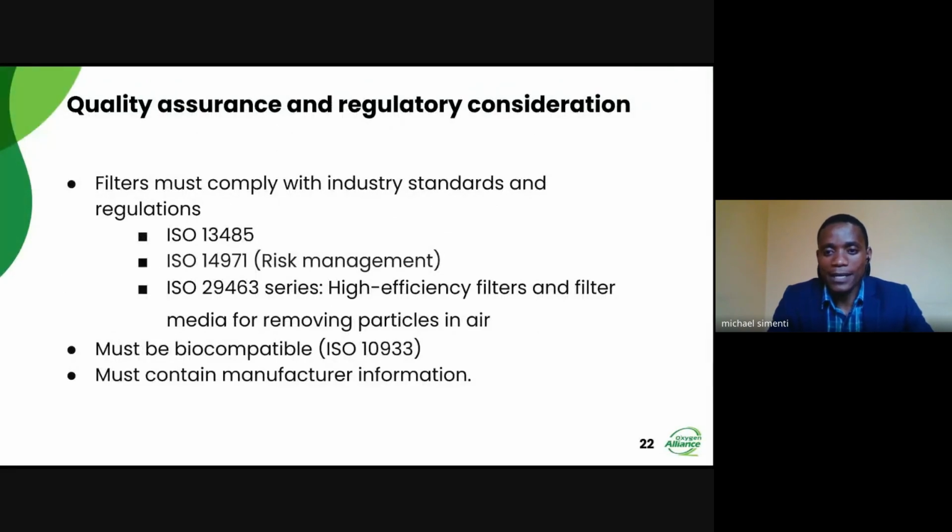Moving forward, let's also look at the quality assurance and the regulatory considerations. As engineers, it is most important to make sure that any device that we're using is complying with the regulatory standards. So the different standards that talk about medical devices, we need to take time to go through them and study them, because if we do so, we'll be very familiar with these standards. And whenever a device comes into our health facility, we'll be able to check if it is complying with the standards.